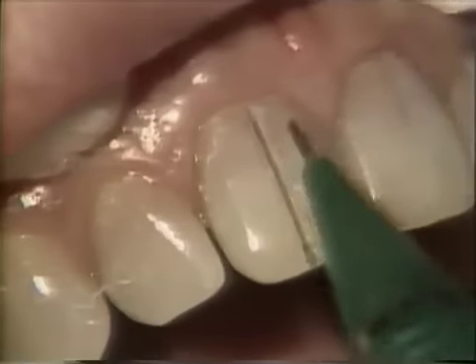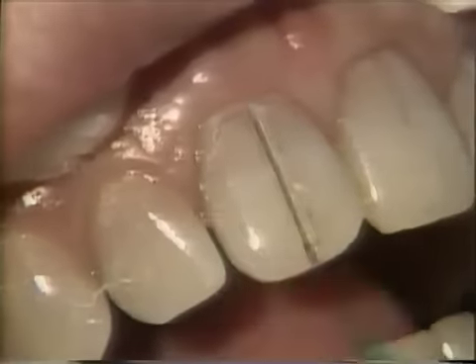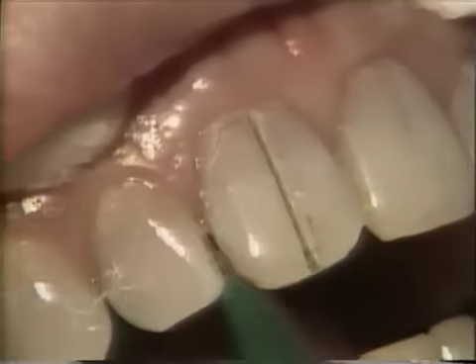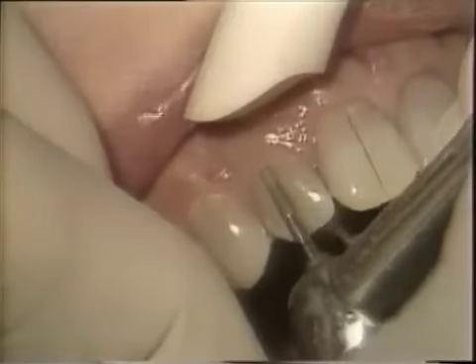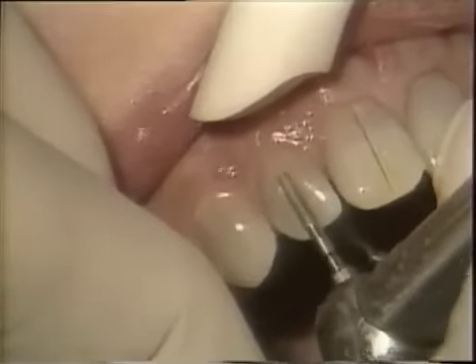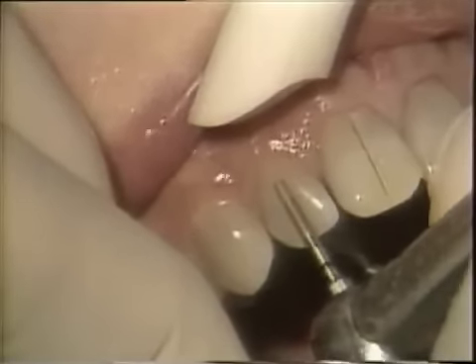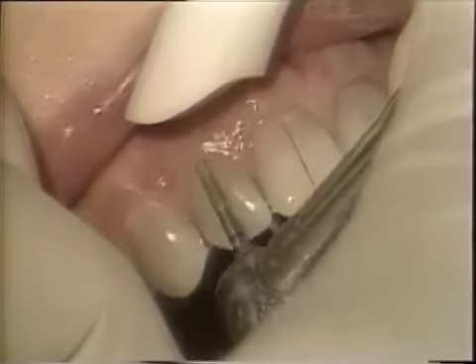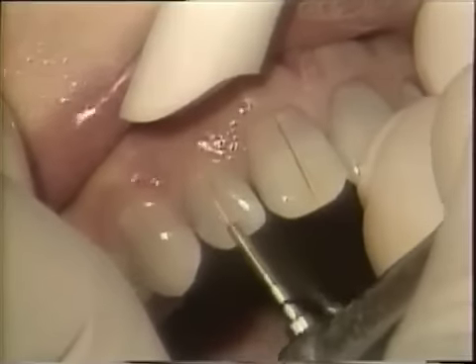Now we will take that same diamond and make a chamfer at the cervical going into the interproximal, and we'll then do that on the rest of the remaining teeth.